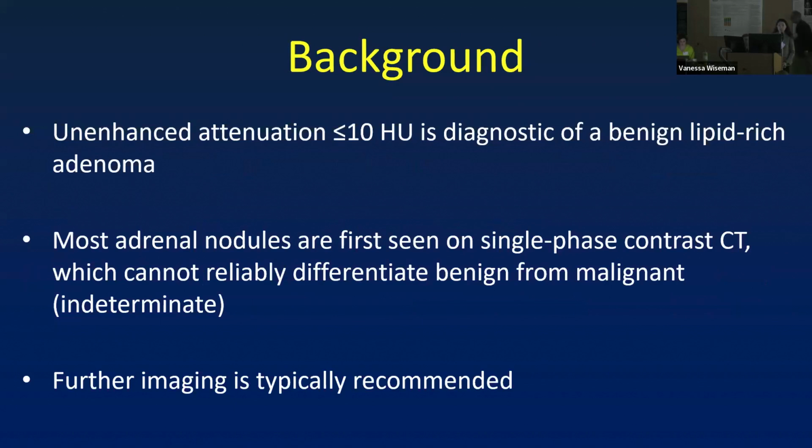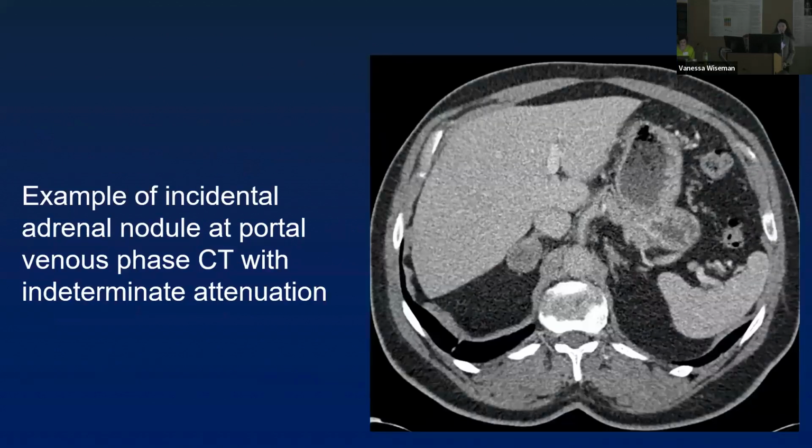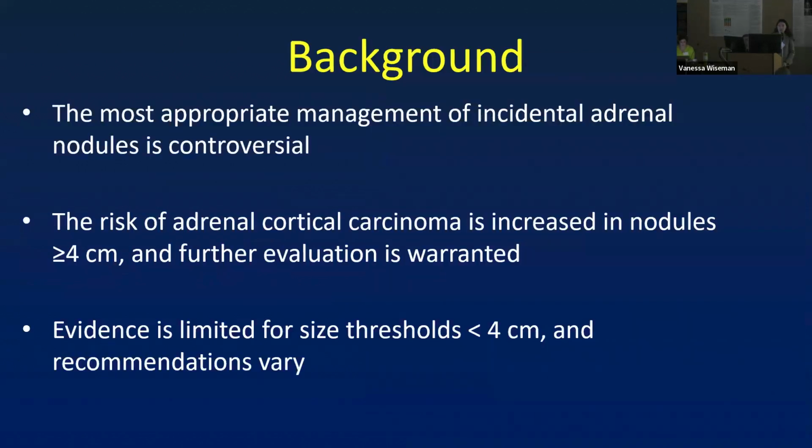However, most adrenal nodules are first seen on single-phase contrast CT, which cannot reliably differentiate benign from malignant. So further imaging is typically recommended. And here's an example. Management of incidental adrenal nodules is controversial. The risk of adrenocortical carcinoma is increased in nodules 4 centimeters or greater. Therefore, further evaluation is warranted. However, below 4 centimeters, evidence is limited and recommendations vary.